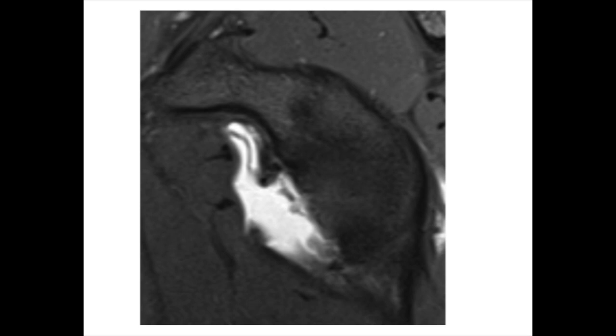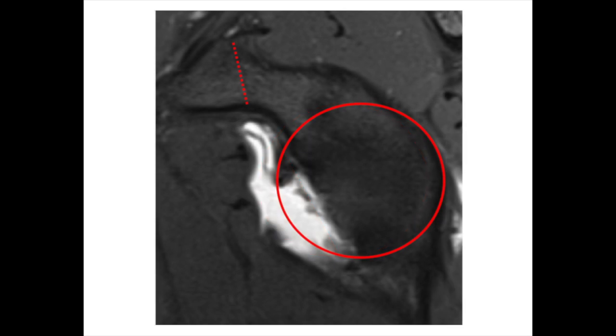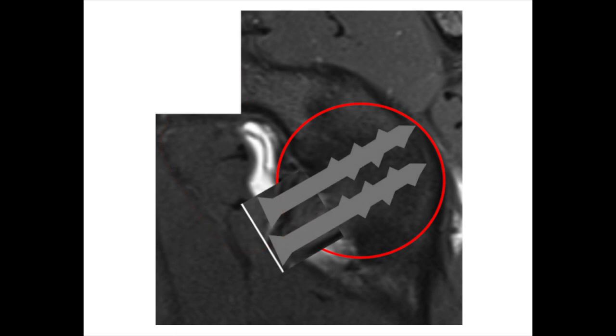The shoulder is a ball and socket joint, and when the shoulder dislocates, it can damage the front rim of the socket. If too much bone is lost off that rim, the shoulder can keep dislocating because of that defect, just like a golf ball sitting on a broken golf tee will often fall off. In this procedure, the bone from the front of the shoulder called the coracoid is cut and then moved through a split in the front rotator cuff muscle called the subscapularis onto the front of the socket, to build a new front rim of the socket and fix it there with two screws.